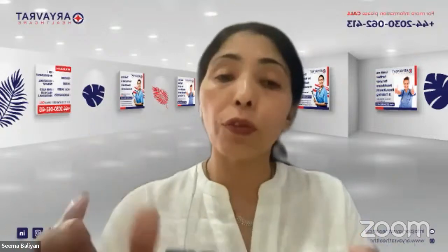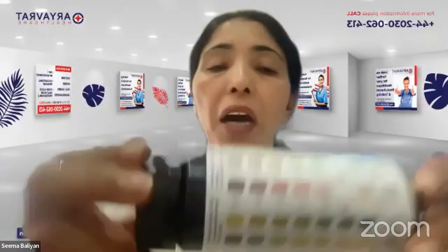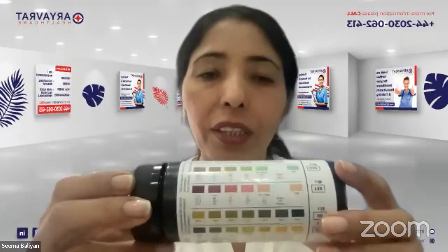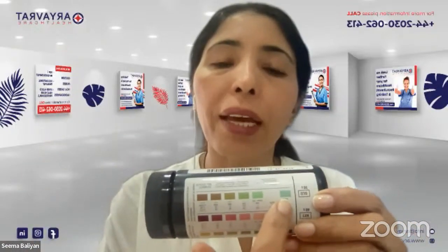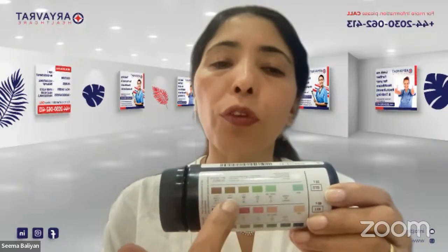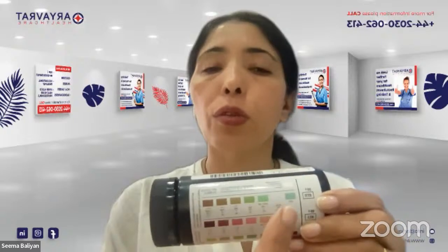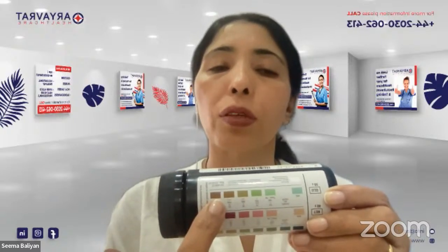But if there is a lot of glucose present in your urine, it is going to turn very dark. Like if you see this one, I don't know whether you can see this or not. So this is for the glucose. If you can see, the normal is green, but if there is a lot of glucose over there, it is going to turn almost brown. So this will tell the intensity of how much glucose is present.